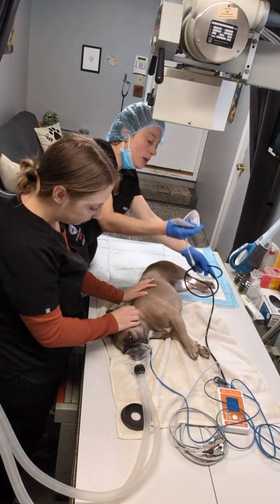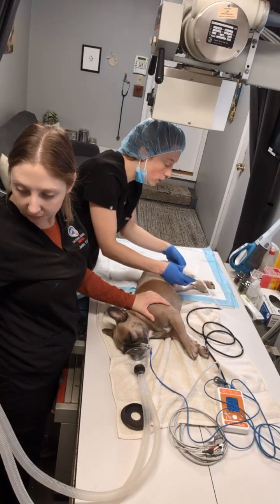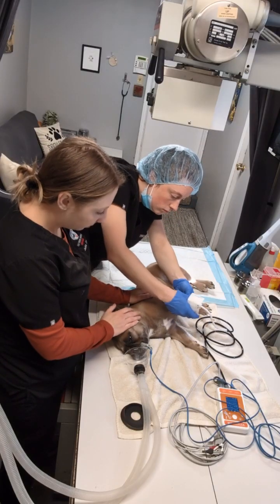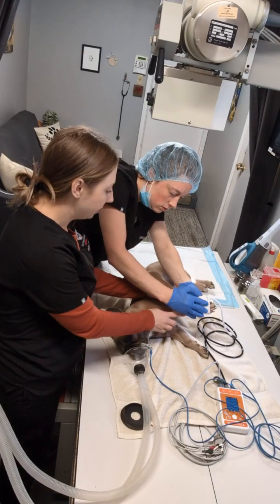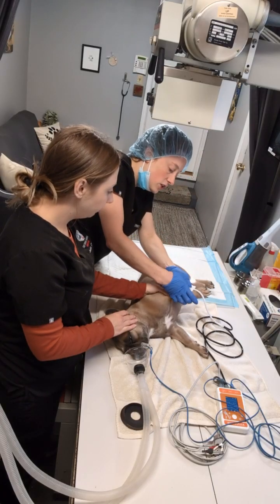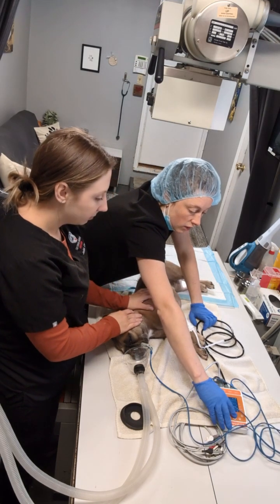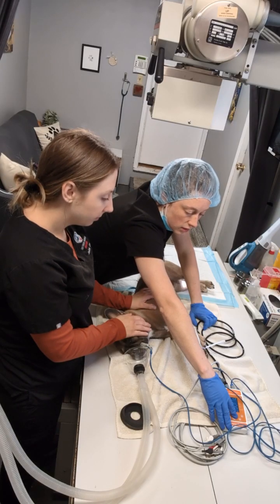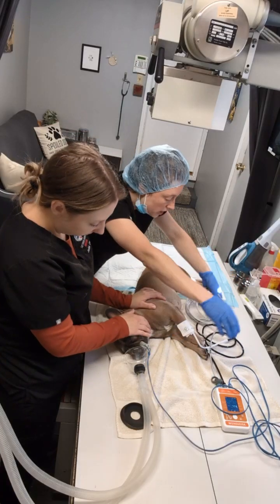We've got the blood pressure monitor, and that just goes to a cuff. We can put that on a forelimb or a hind limb. I want to make sure I secure it tightly to the forelimb, and then if we hold down the blood pressure button on the machine, it will automatically inflate the cuff and measure the blood pressure.